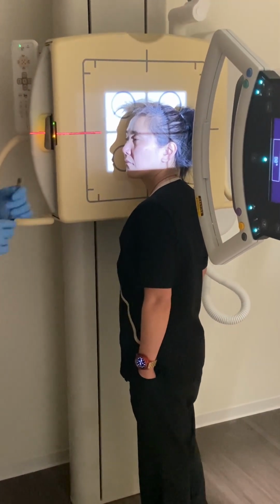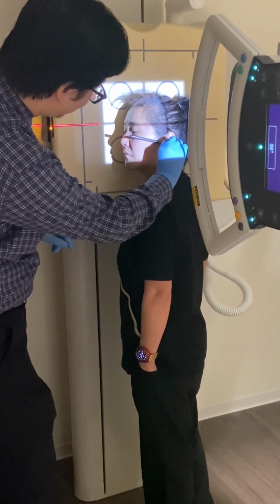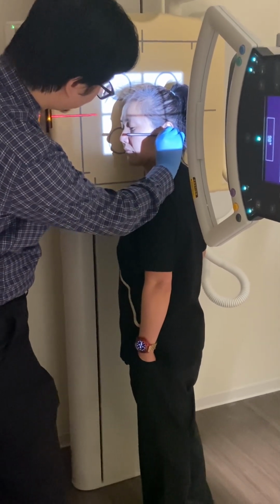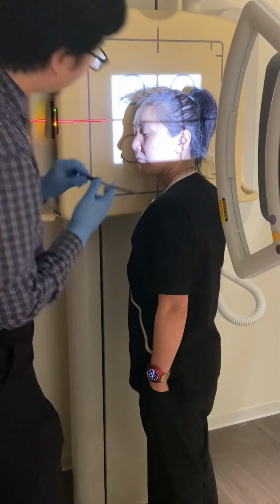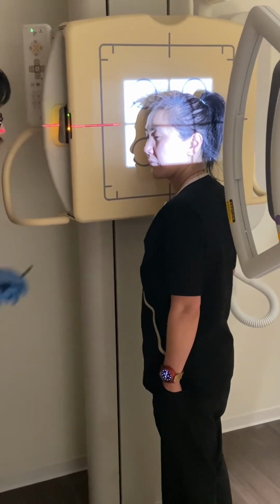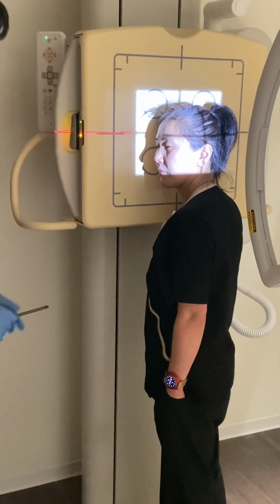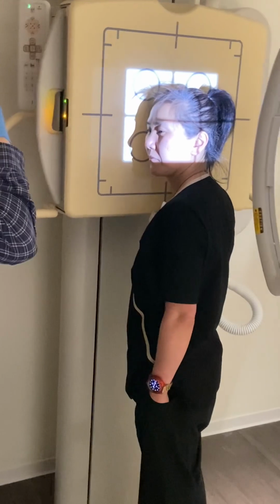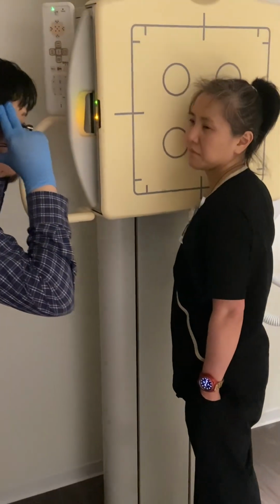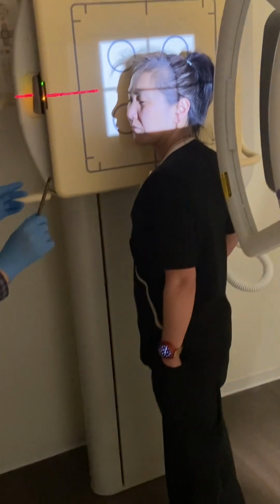All right. First things first, IOML. Okay, bring your chin down. Chin down. Good. Okay, so there's my IOML, right? Nice and flat. Right. Okay, now I come over here. I can see that my patient's head is tilted this way. So, I need you to take the top of your head and turn it like this. And then just touch your ear. Oh, too far, go the other way. Good. Touch your ear. All right.